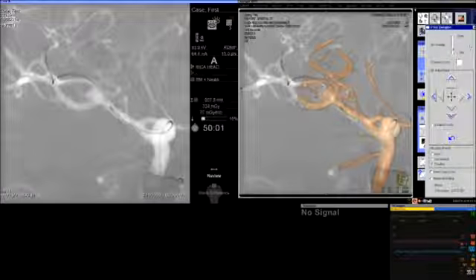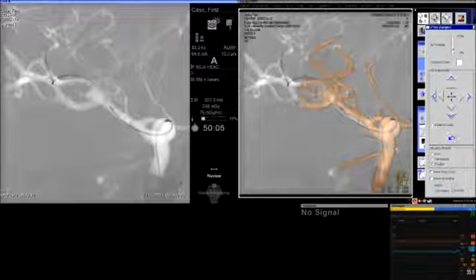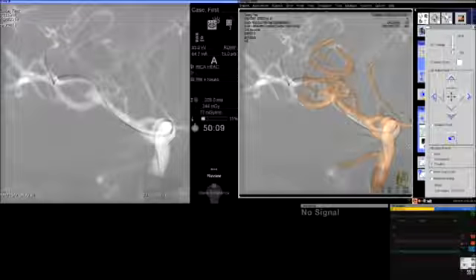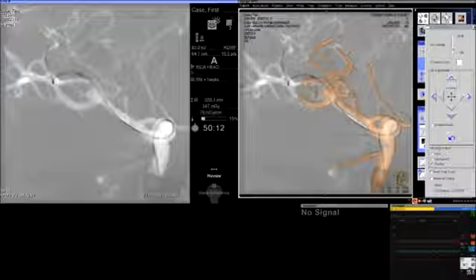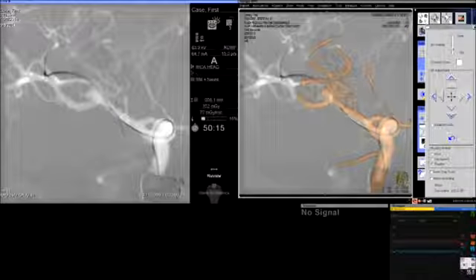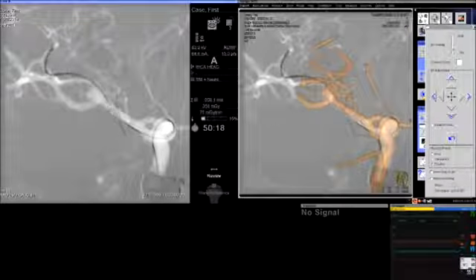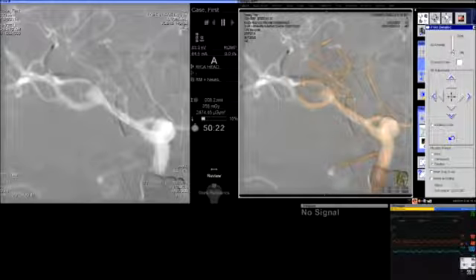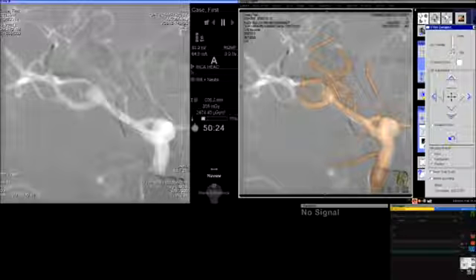But also you want to position the wire, the transition portion between the soft and more sturdy segment of the wire, right at the bifurcation, so you can see how the microcatheter goes through the aneurysm area without buckling into the aneurysm, and this position is also very crucial to have a distal placement of the microcatheter, so that when you navigate your stent into this location, you will not have any chance of losing your catheter position.